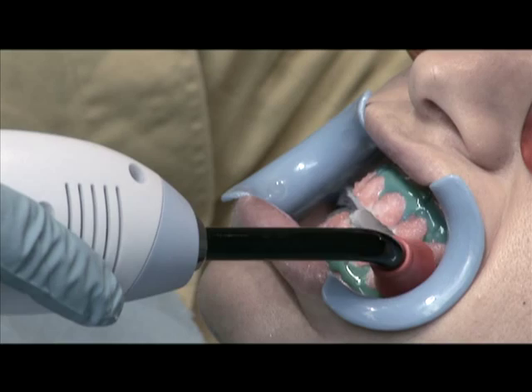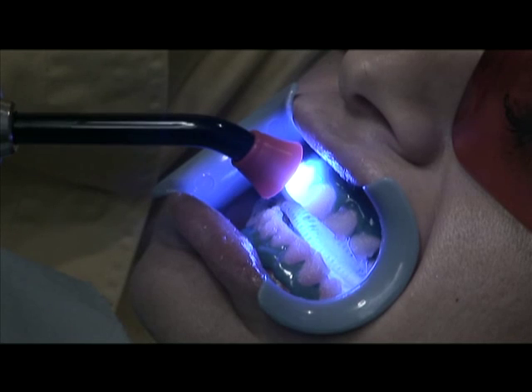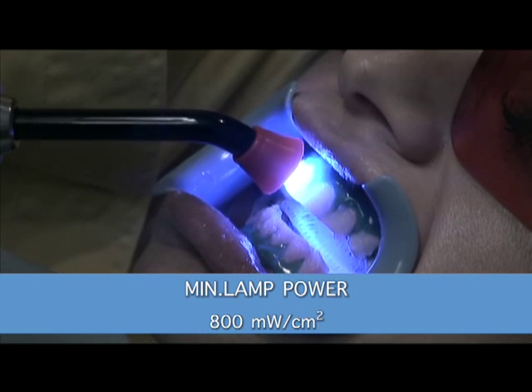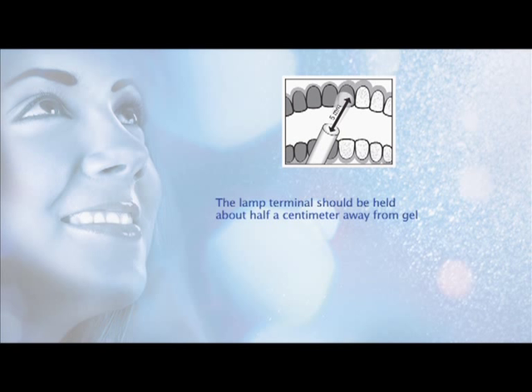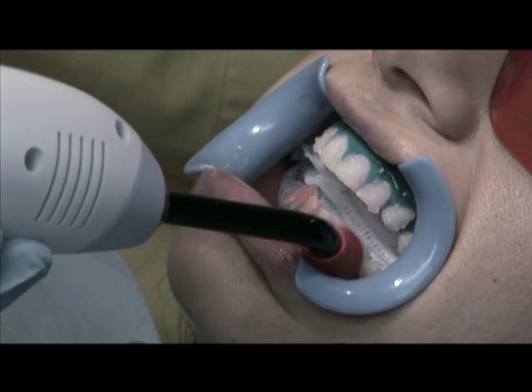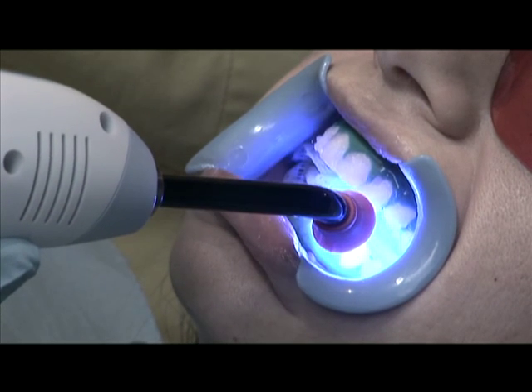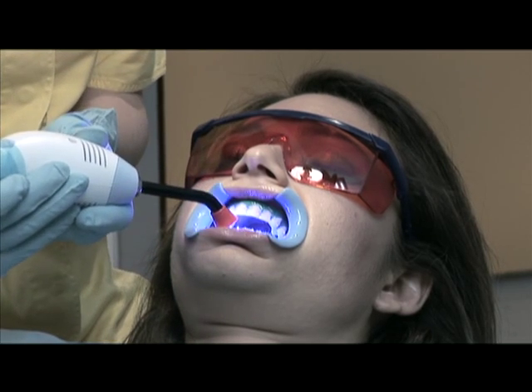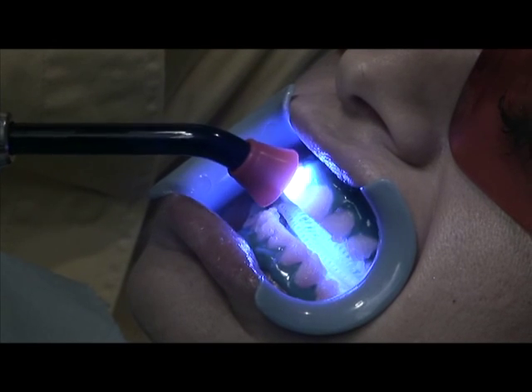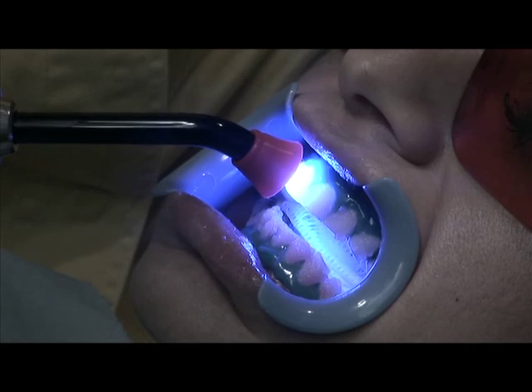After applying the gel on both arches, photoactivate it tooth by tooth using a polymerizing lamp with a power of at least 800 milliwatts per square centimeter. The lamp terminal should be held about half a centimeter away from the gel; greater distances may lengthen activation time. The colour of the gel will change from bright pink-orange to white, indicating that the whitening reaction has taken place correctly. The reaction is completed when the gel becomes white. While wearing protective goggles, you can observe the photodynamic reaction — the gel will become bright yellow and then slowly fade to white as the chromophores are depleted.